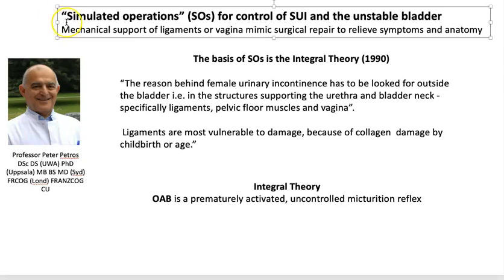I will discuss today simulated operations for control of stress incontinence and the unstable bladder. It is a clinical test. Mechanical support of ligaments or vagina mimics surgical repair to relieve symptoms and anatomy. The basis of SOS is the integral theory.